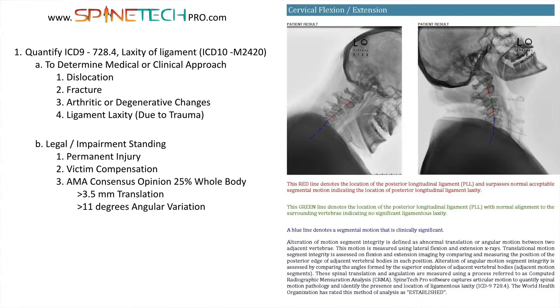Now, in these images you'll see red, green, and blue lines. The red lines denote the location of posterior longitudinal ligament injury that have surpassed the normal acceptable segmental motion limit, and that indicates ligament laxity.